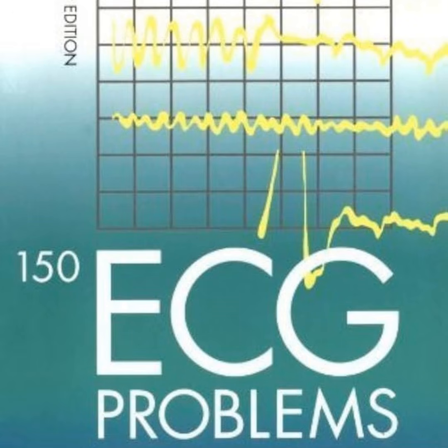I mean, an echocardiogram will confirm the asymmetric septal hypertrophy and demonstrate systolic anterior movement, or SAM, of the mitral valve apparatus, where the valve leaflets are literally pulled into the outflow tract by the Venturi effect. It really is a structural nightmare, presenting as an electrical mystery. Which honestly brings us full circle.